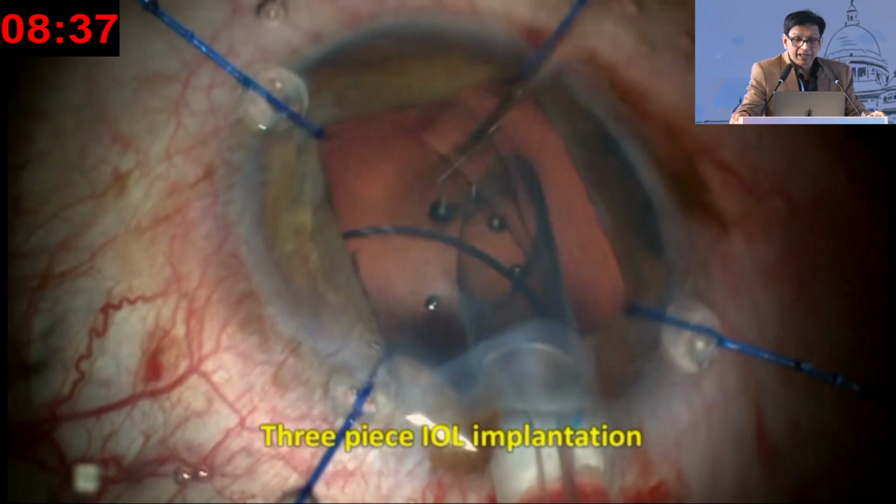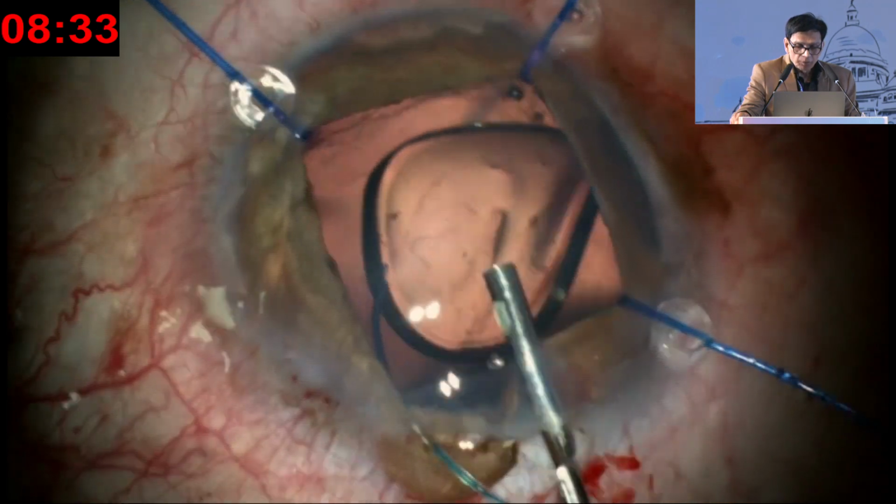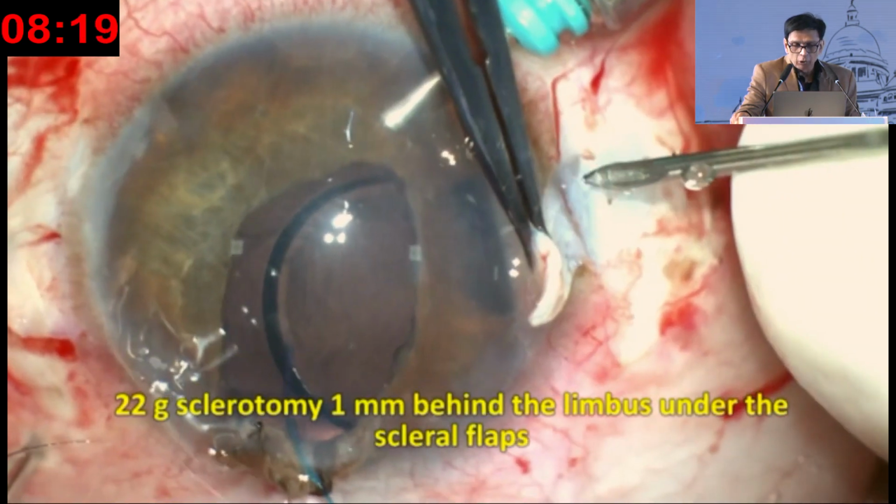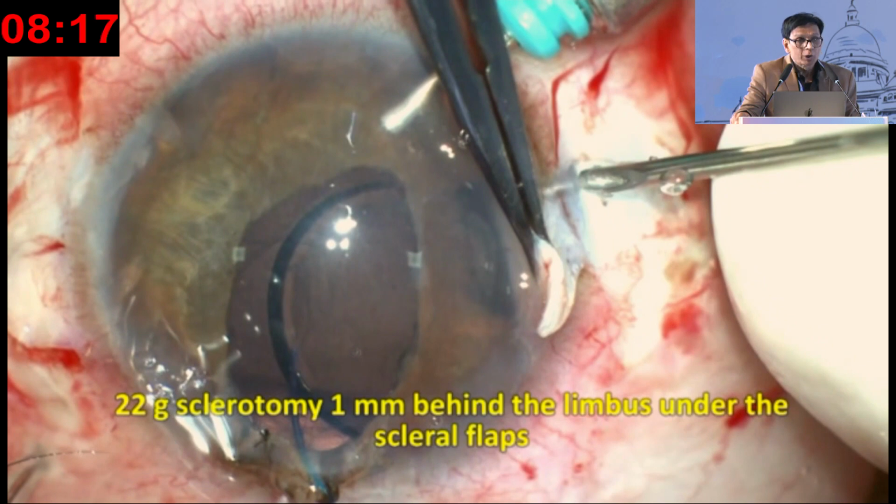Once you don't have that, I thought, okay, I'm stuck now. Let me see what I can do. I thought, let me implant the lens in the sulcus, but I realized that the lens is going down. You can see the IOL leading haptic in the vitreous. So I know now the only solution I have is to do a glued IOL.